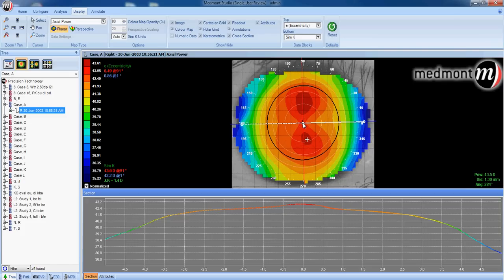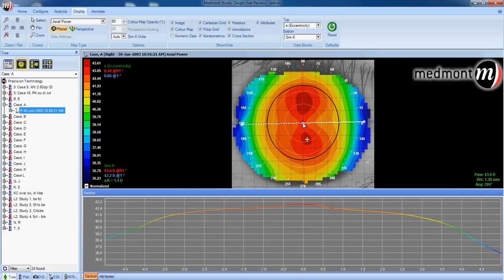The center of the topography would be the visual axis. This would be the point the patient is fixating at the moment the map is taken.